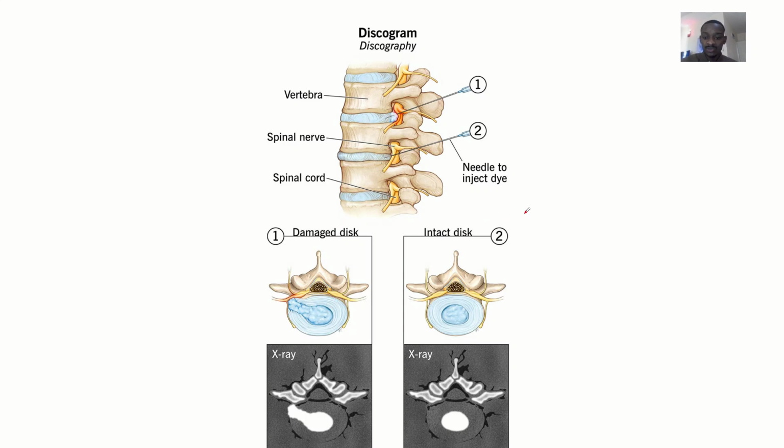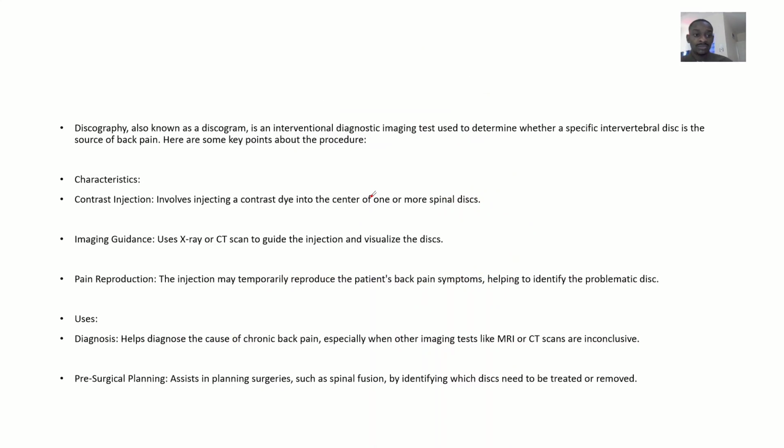And this form of imaging modality is just like the name implies. It's mostly used to check out your spinal disc. So you're trying to find out which of the spinal discs actually has a problem. Okay, so we'll talk about this imaging modality.